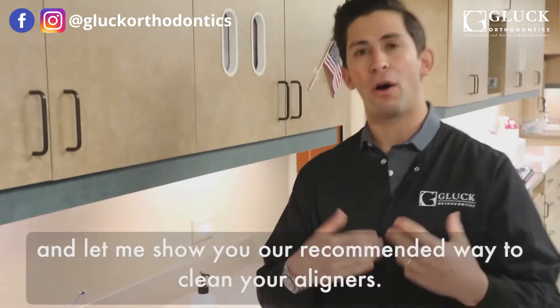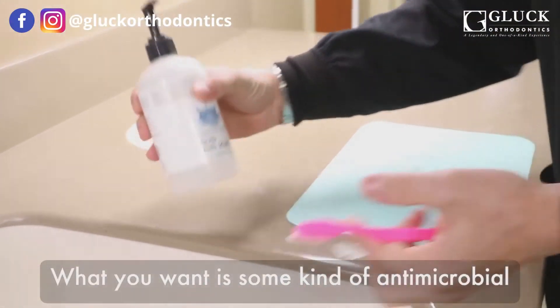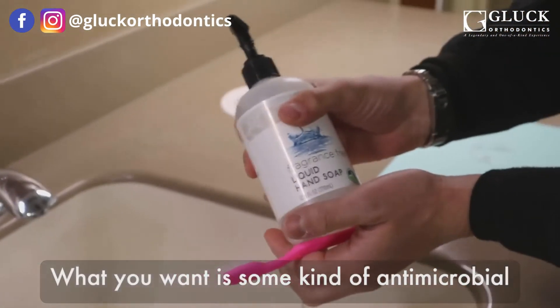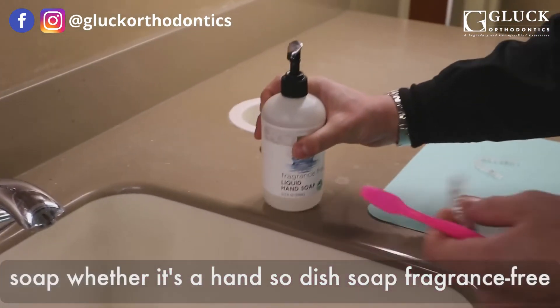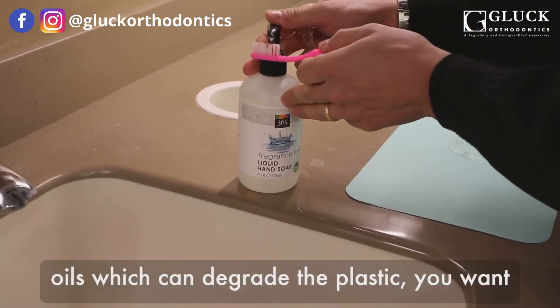So come on over and let me show you our recommended way to clean your aligners. What you want is some kind of antimicrobial soap, whether it's a hand soap or a dish soap. Fragrance-free is preferred because it won't have any of the oils which can degrade the plastic.